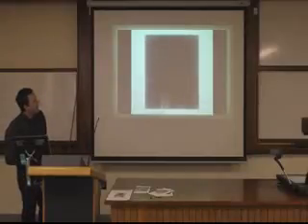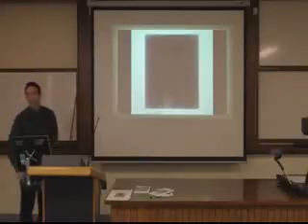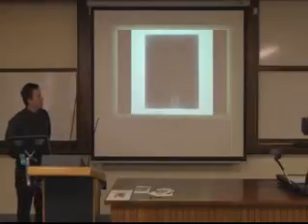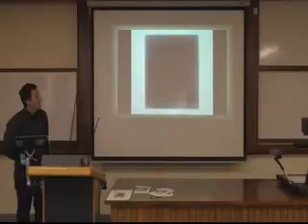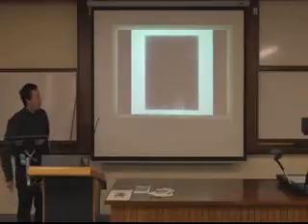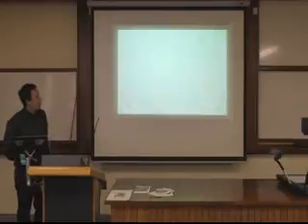And this is the one I didn't do stereoscopic because you don't have access to the synchronous images. But it still shows you can see that there's 2D tracking going on. And there's never a detection failure in this one because the image is so clean, because there's no treatment couch attenuation in there or bone, and so this actually has no detection failure. So that finishes there.